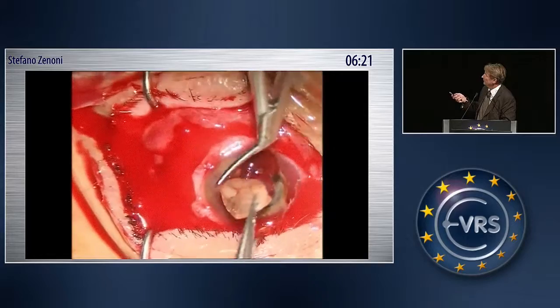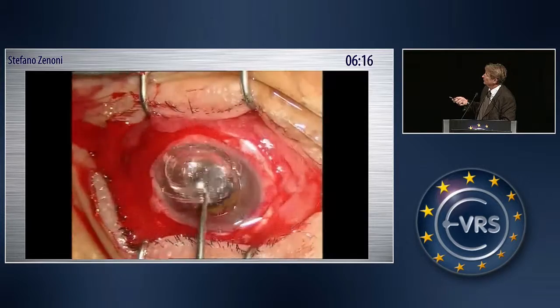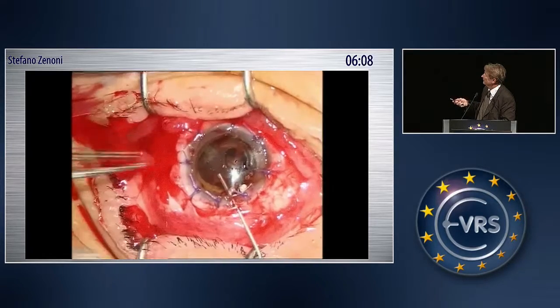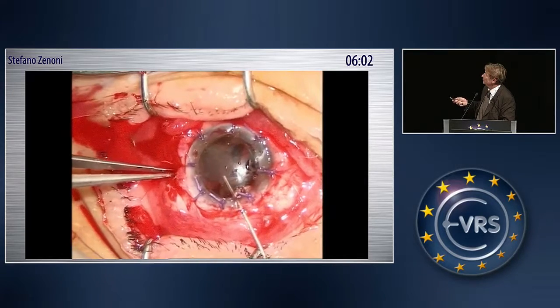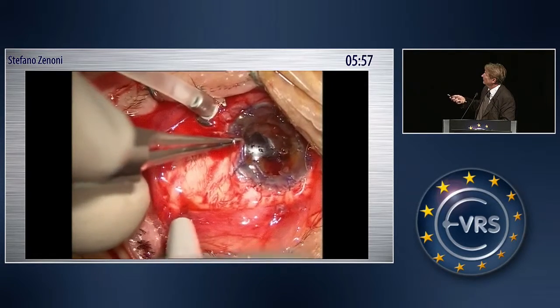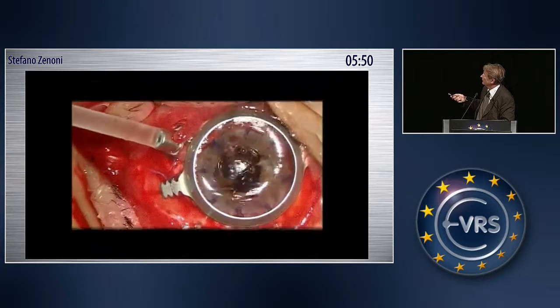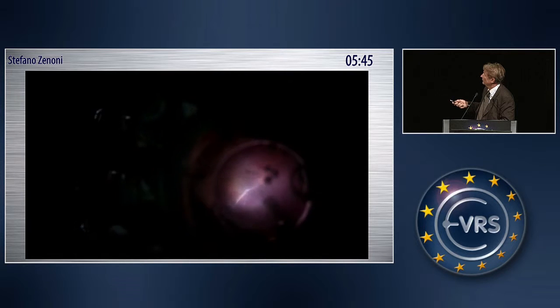So what we have to do is to create spaces in the anterior chamber, just to put in an infusion and to be able to work. So the first thing that we did was to put in this prosthesis, and then to put some viscoelastic substance to create a new anatomical space to perform this infusion. Then we drained the subchoroidal hemorrhage, just to create another space. So we have to walk little by little from the cornea to the retina.